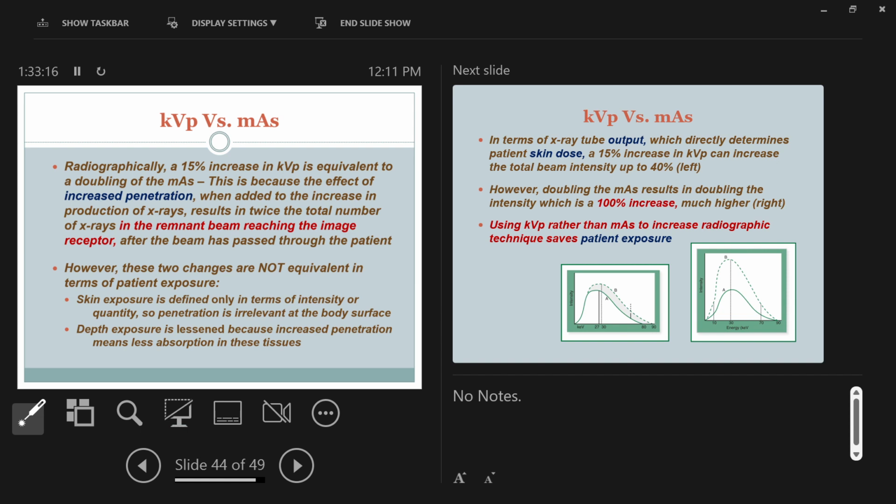So let's talk about in the X-ray beam, what is KVP controlling? It's voltage. But I want to talk about in the X-ray beam. So you make a setting on the computer, but how does your X-ray beam change with increasing or decreasing voltage? Let me rephrase this. Did you make characteristic radiation at low kV settings? What was the minimum setting needed to make characteristic radiation? That's the characteristic X-ray that was produced, but the minimum is 70 kVp, 69 or 70, right?